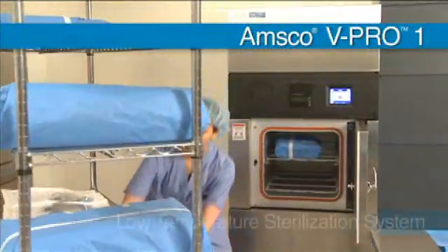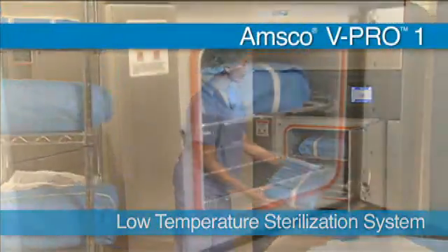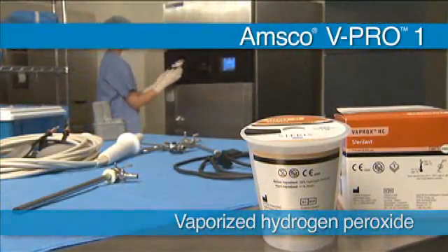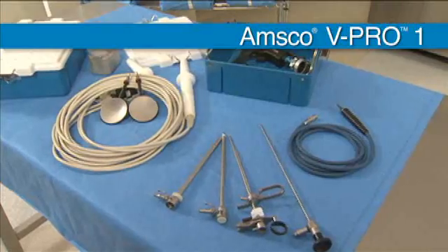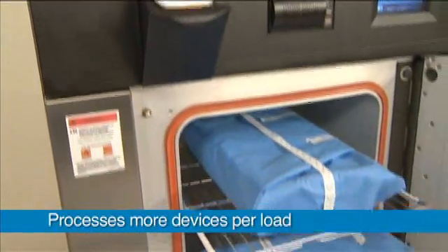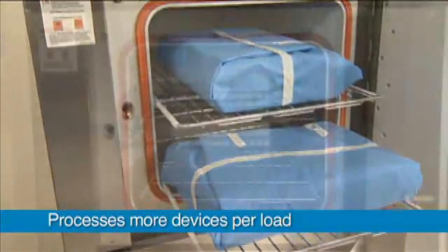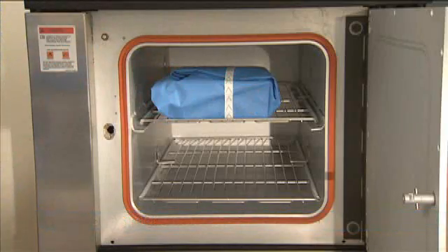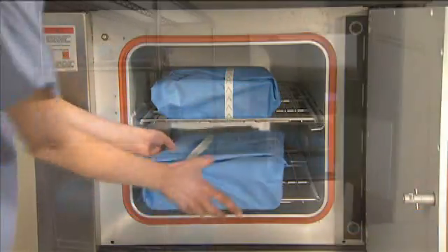The AMSCO V-PRO-1 Low Temperature Sterilization System uses vaporized hydrogen peroxide to quickly process high volumes of heat and moisture sensitive devices. In fact, V-PRO-1's large rectangular chamber can handle up to twice as many lumen devices per load than comparable gas plasma sterilizers.